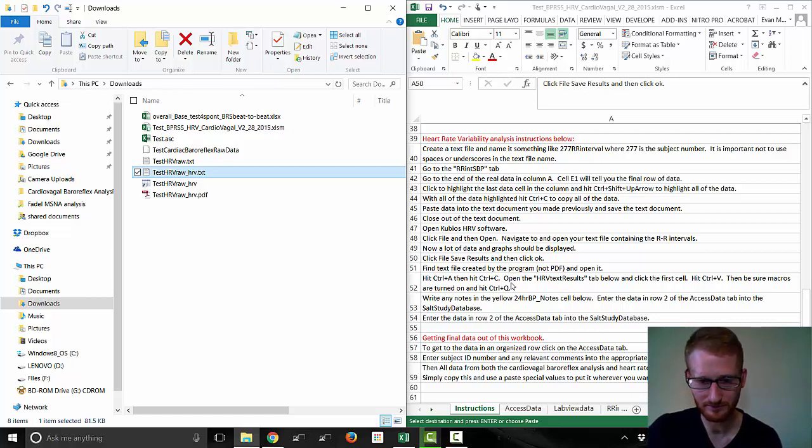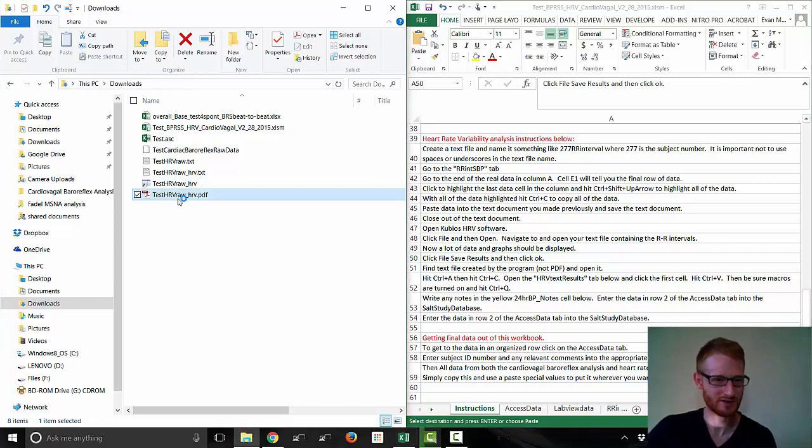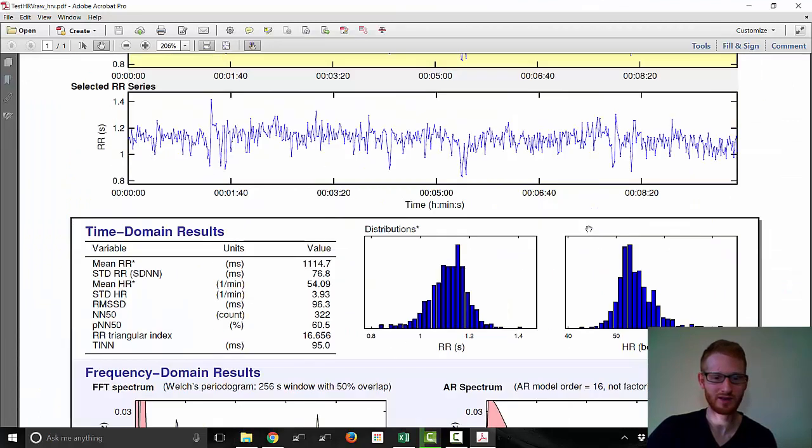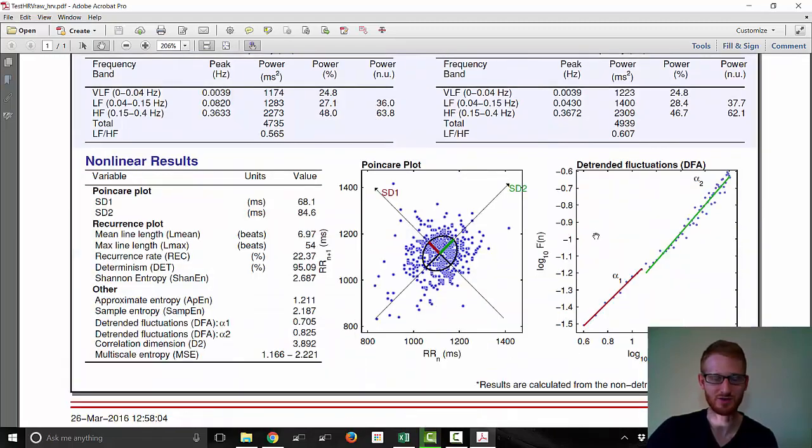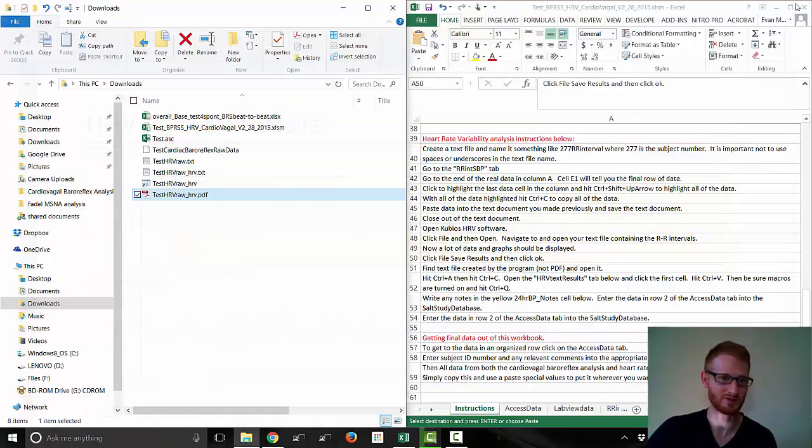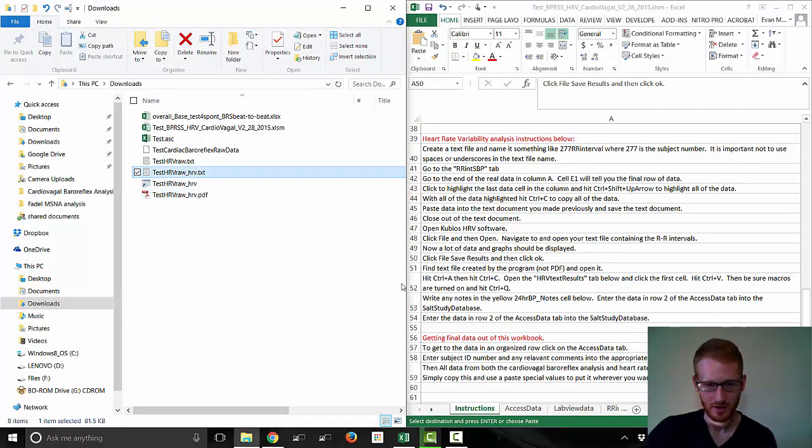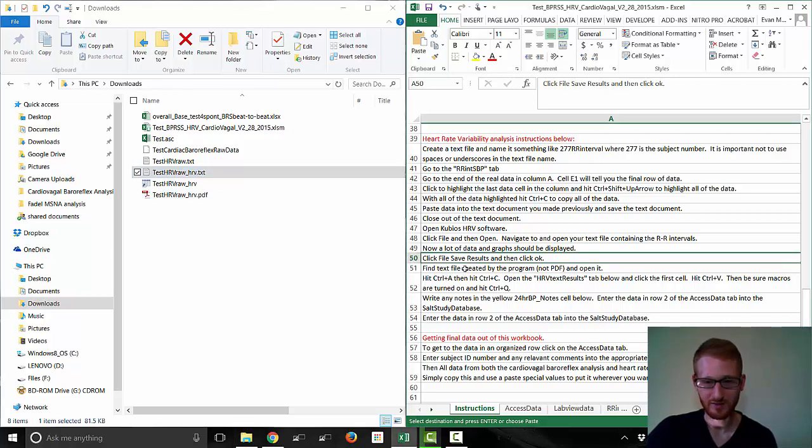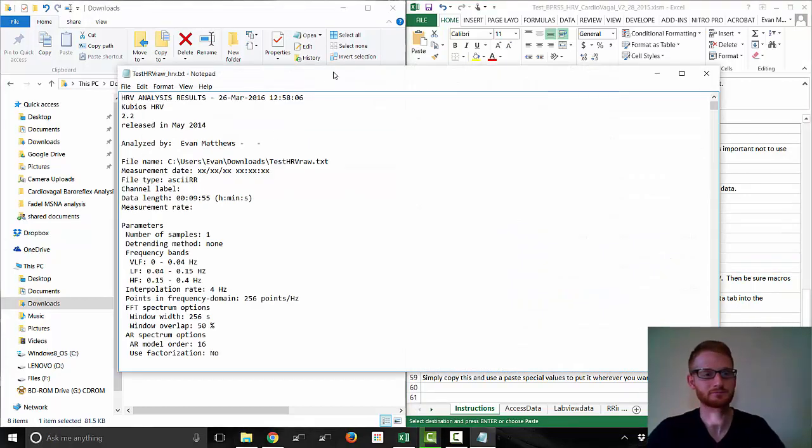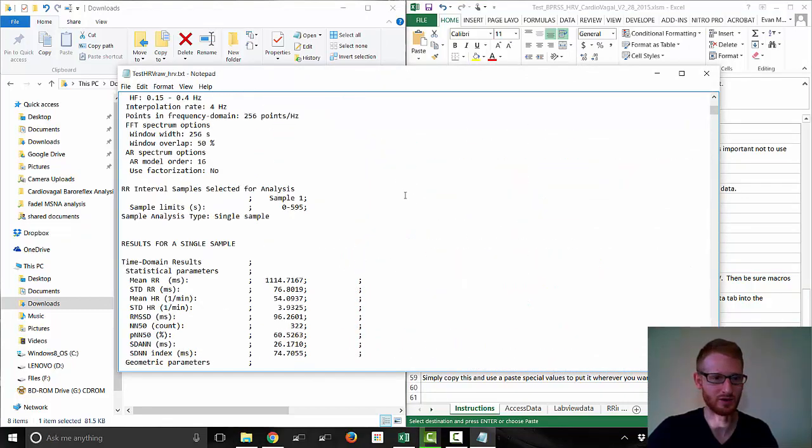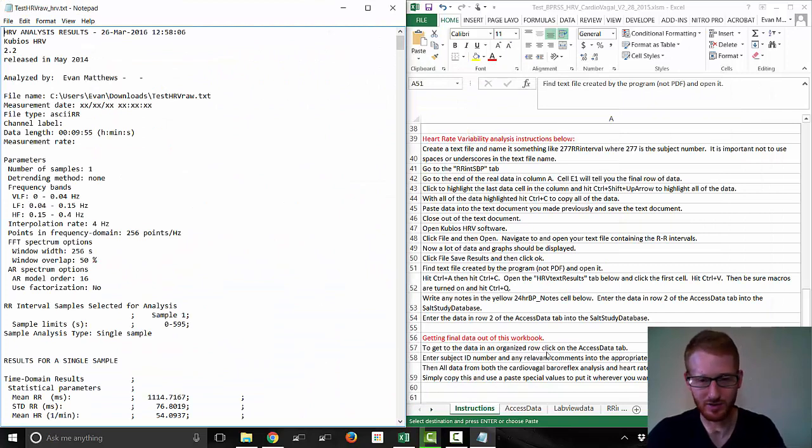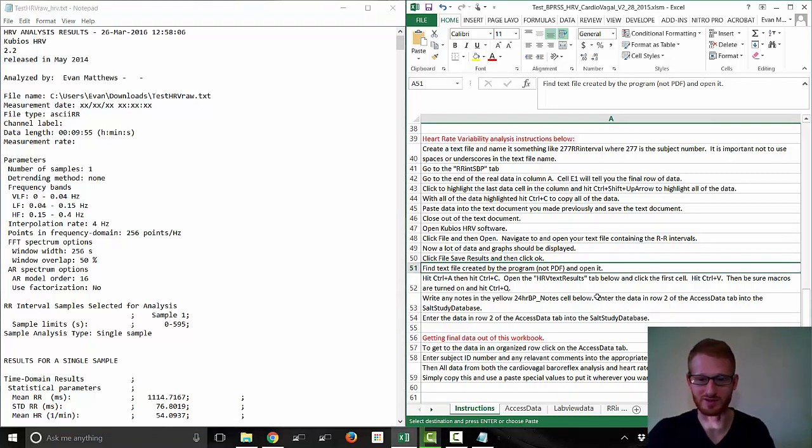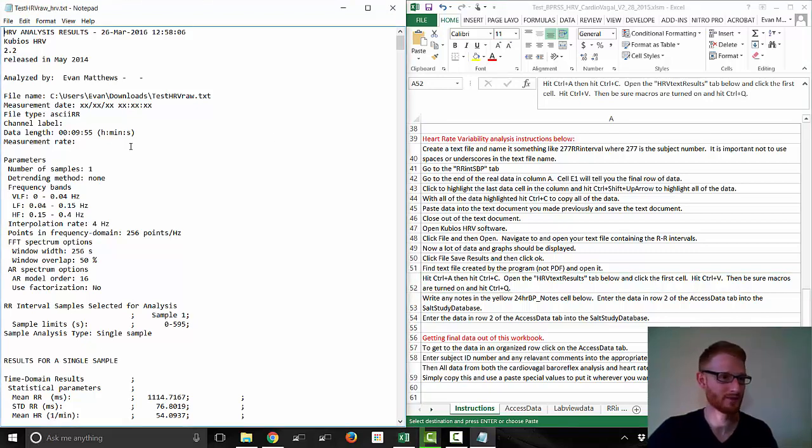Here is the information that it just created. So these three files, and this is the raw file. Now what we're going to do is get the data out of this. This PDF, let me just show you this real quick. I believe this is sort of an output of everything, it's going to show you all those graphs that we saw before. This is nice to have just so you can see it, but we're not going to use this. We're going to use the text file here. So find the text file created by the program, not the PDF, and open it.